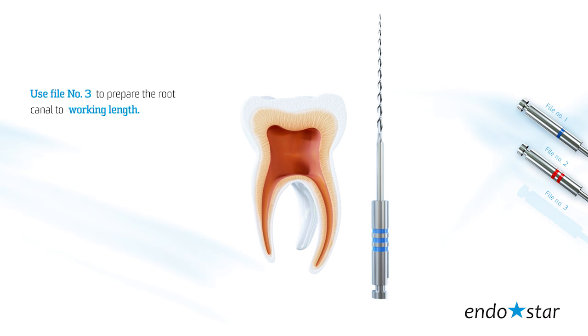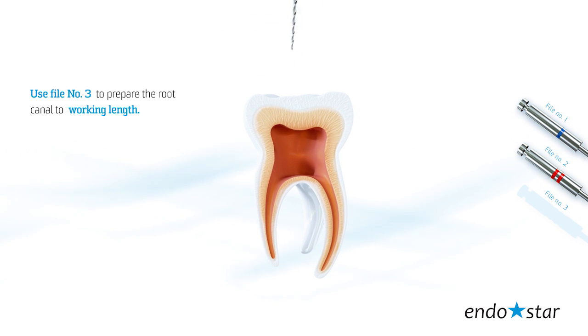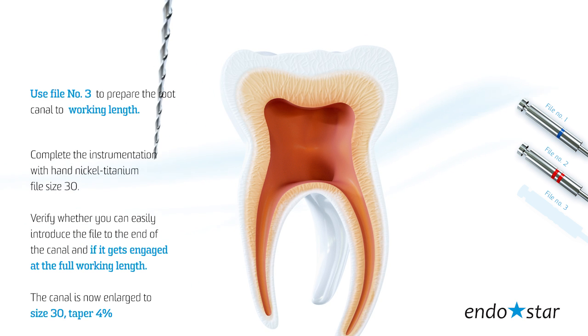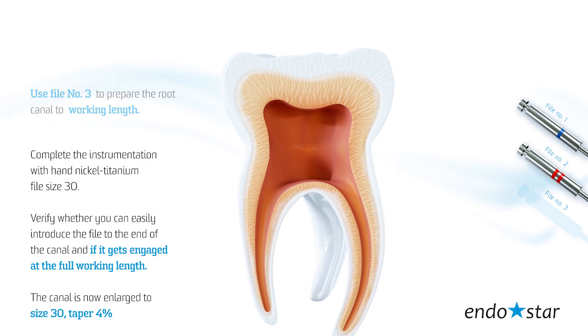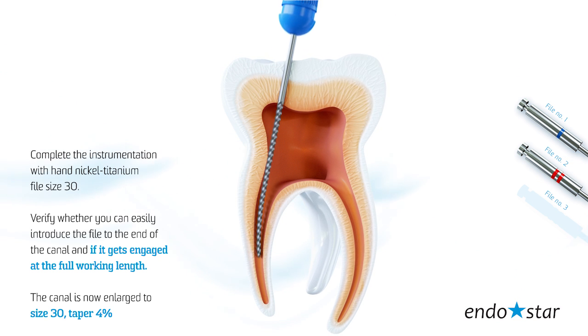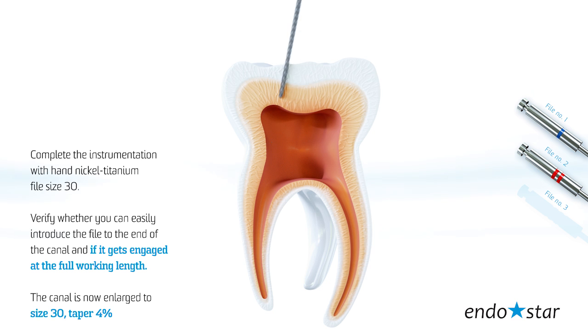Use file number 3 to prepare the root canal to working length. Complete the instrumentation with hand nickel-titanium file size 30. Verify whether you can easily introduce the file to the end of the canal and if it gets engaged at the full working length. The canal is now enlarged to size 30, taper 4.